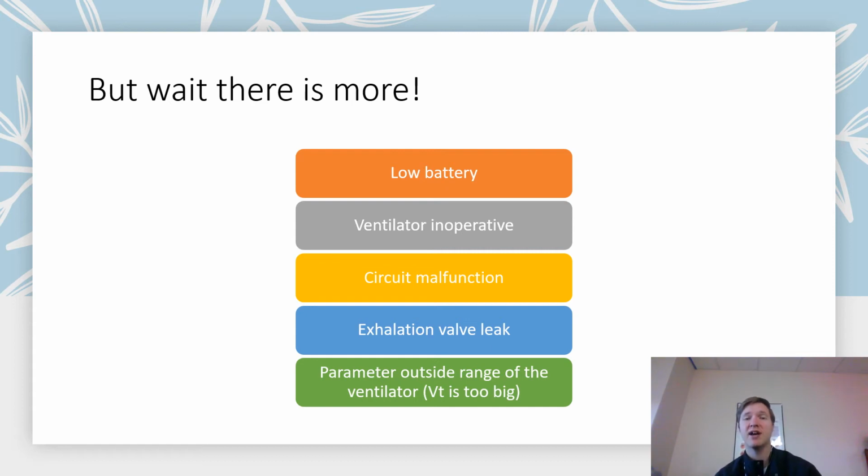If the ventilator becomes inoperative, and traditionally that's going to be a high level alarm, sometimes this happens when it fails a short self-test. RRTs, or the ventilator companies, will call that SSTs, short self-tests. So it'll say ventilator inoperative. In other words, it's not calibrated right. It's not going to be able to deliver a breath with reliability. So you'll see that alarm there.